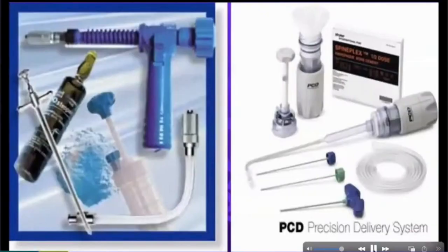This is an important slide. When I have to inject my cement in, I put the patient on an extension. I take one or two more pillows, extension, so that the entire spinal column is deloaded. And I do some traction also in some patients. This is very, very important when about to cement.